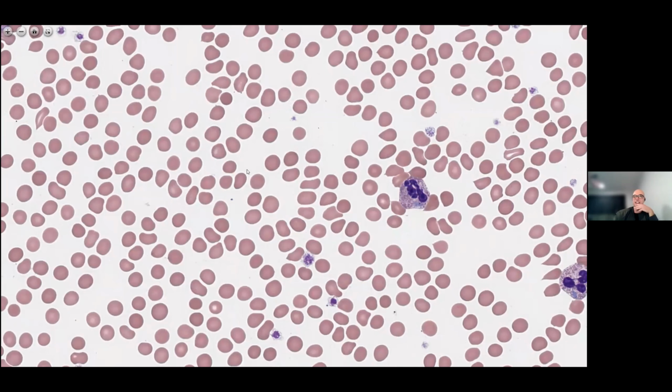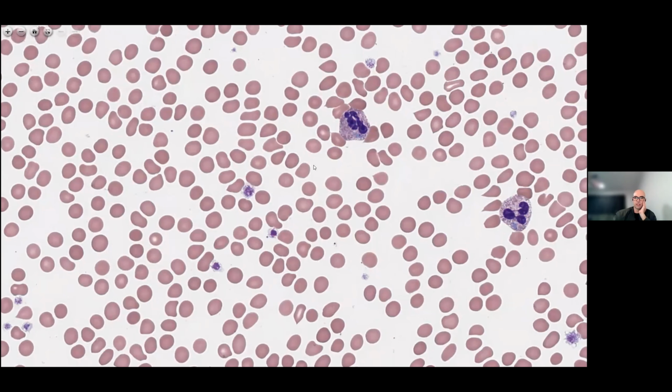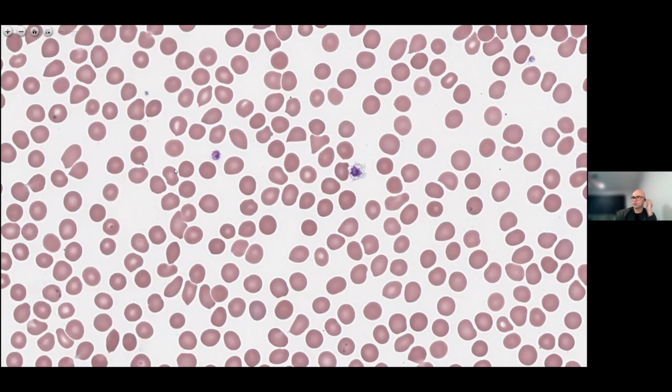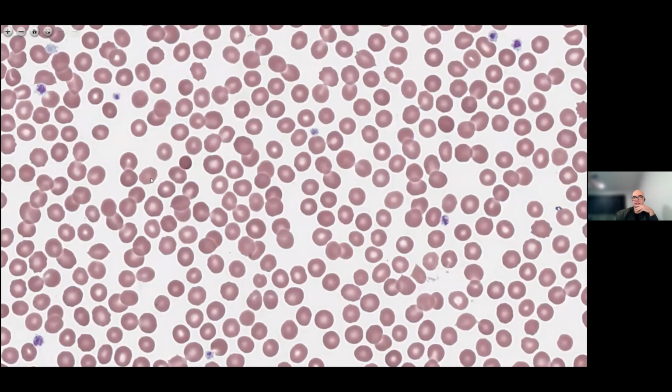So with gray platelet syndrome, you would expect to see hypogranular or agranular platelets. That's where the name gray platelet comes from, because the platelet wouldn't have these basophilic, darkly purple staining granules. It would just look like, imagine some monocyte cytoplasm that's free by itself, about this size. And I'm not sure if gray platelet syndrome even has macrothrombocytes, like large platelets, but don't quote me on that, because it's been quite some time since I've read into it.